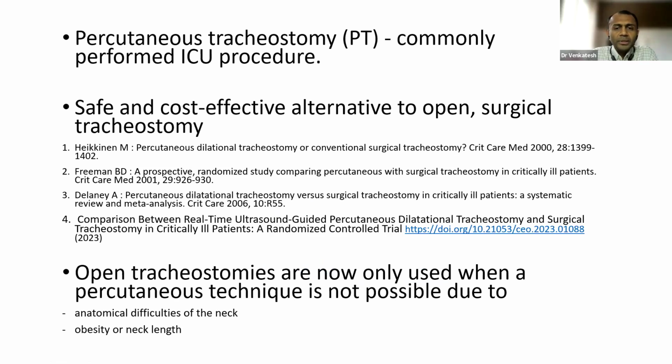Nowadays, open tracheostomies have reduced. The numbers have come down significantly, only in cases where there is anatomical difficulty of the neck or obesity or there is a problem with the length of the neck. But we will see how even in obesity, ultrasound helps.